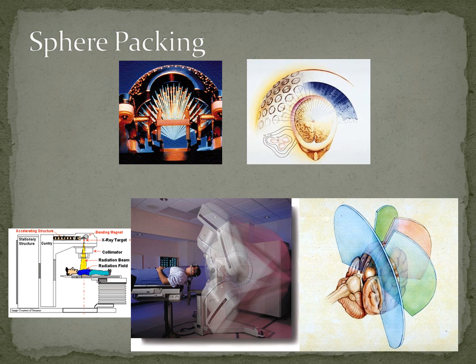Friedman showed in his previous lecture, you could do it a bunch of different ways. The Gamma knife is probably the device which is used on the most patients in the world. Linear accelerators, also by using multiple arcs of radiation, could also create spheres of dose. And so by these two techniques, you could actually create very dense spheres of radiation dose, and you can use these spheres of dose placed over target tissues to treat the targets.